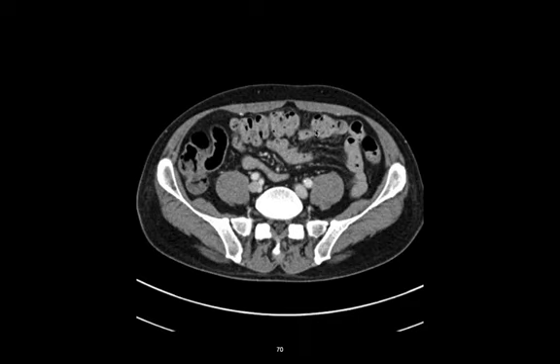All right, everyone. So there is basically an overview of the abdominal CT anatomy we've covered.